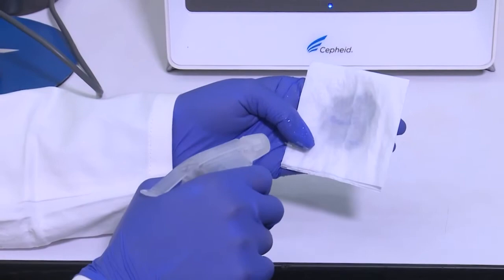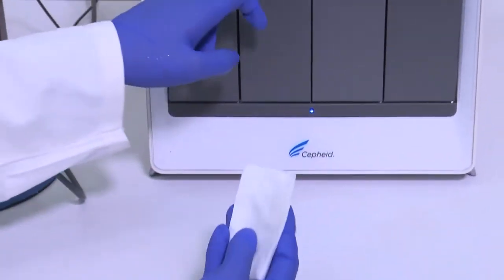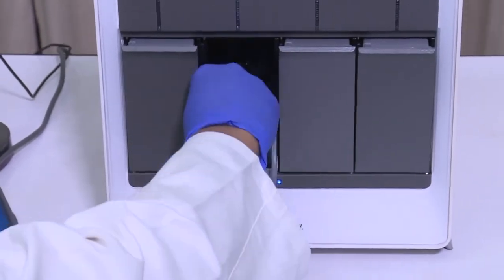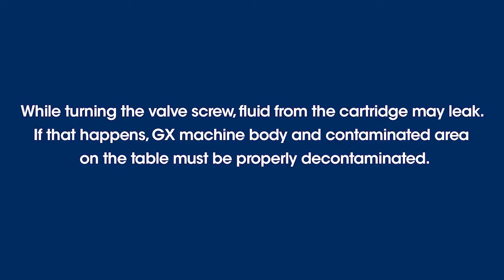Decontaminate the module. While turning the valve screw, fluid from the cartridge may leak, and if this happens, the GX machine body and the contaminated area on the table must be properly decontaminated.